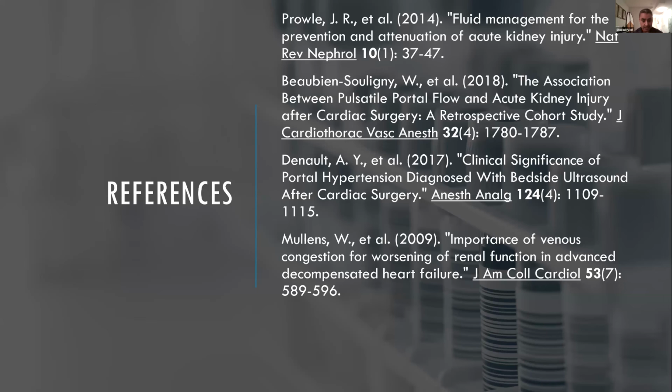As far as confounders, that should always be in your mind. One confounder is a cirrhotic. When you have a scarred down liver, that patient is going to have some pulsatility. So if I have someone who's a cirrhotic, I'm interpreting these with a grain of salt. I will be focusing more on the renal vein than the portal vein in that situation. And there's no reason if they're cirrhotic why their IVC should be dilated as well. So again, I use a method called Bayesian statistics. Basically, I'm changing probabilities of what my primary hypothesis is.